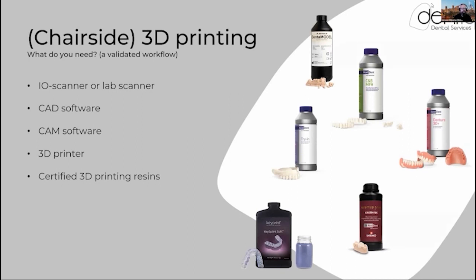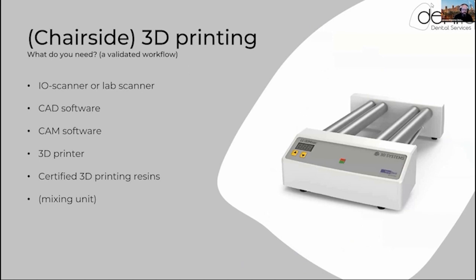Well, we need to have certified 3D printing resins. A lot of manufacturers are on the market like, oh, we are validated. No, they are not. A lot of them are not properly validated. So make sure to do your research and be informed by the reseller that you have actually an approved resin. In the end, it goes into the patient's mouth. And for some resins, they recommend to have a mixing system. So instead of shaking the bottle and shaking air inside, it just rolls around, and we got a properly mixed resin. And that is very important to create high accurate prints.